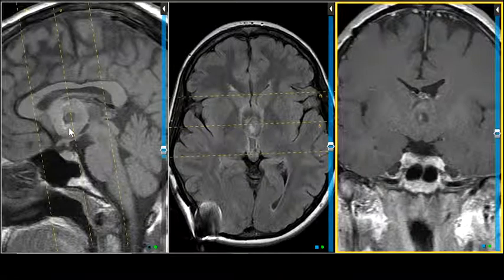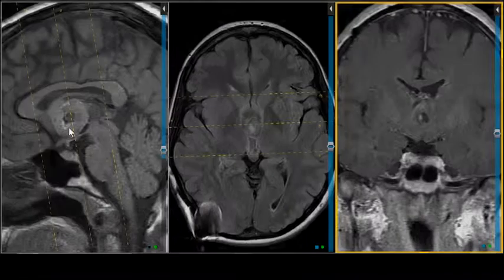And if it is a cranio, it's going to be the solid papillary variety of cranio. And you've seen in a younger individual in an accompanying vignette the adamantinomatous form of cranio, which is more cystic. So this one is solid. If it is a cranio, it's likely to be papillary.